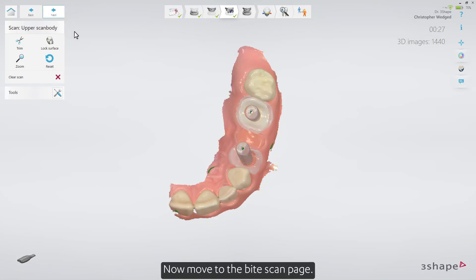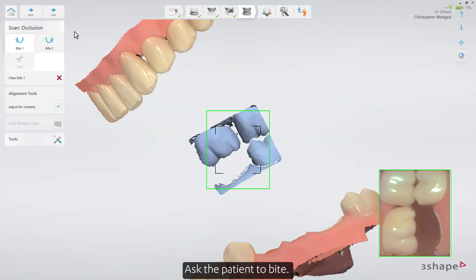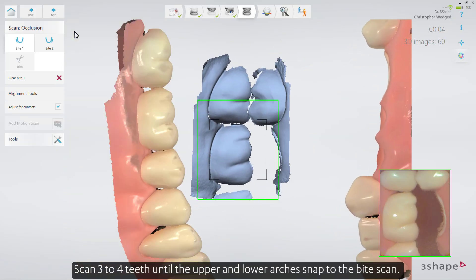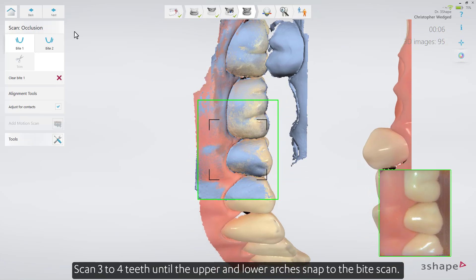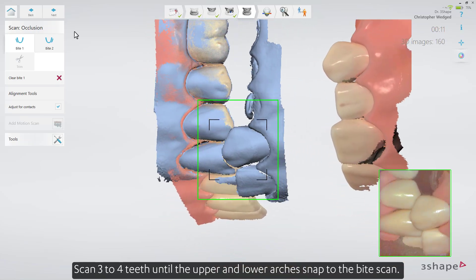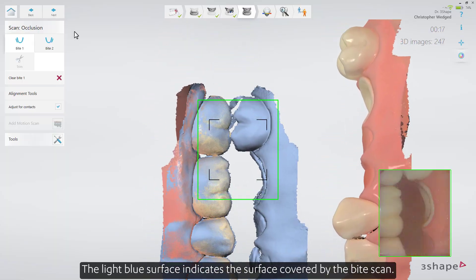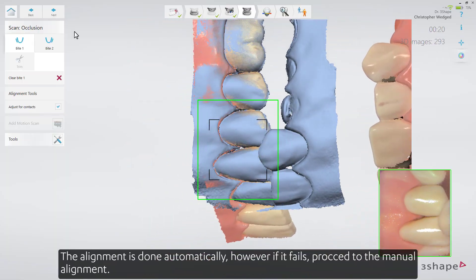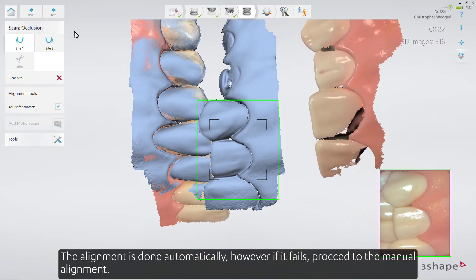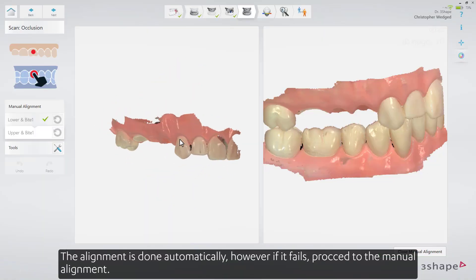Now move to the Bite Scan page. Insert the Scan Tip to the second molar on the buccal side. Ask the patient to bite. Scan three to four teeth until the upper and lower arches snap to the Bite Scan. The light blue surface indicates the surface covered by the Bite Scan. The alignment is done automatically. However, if it fails, proceed to Manual Alignment.